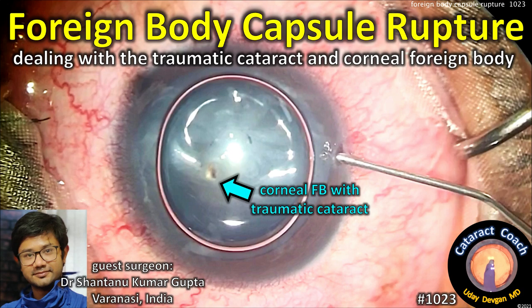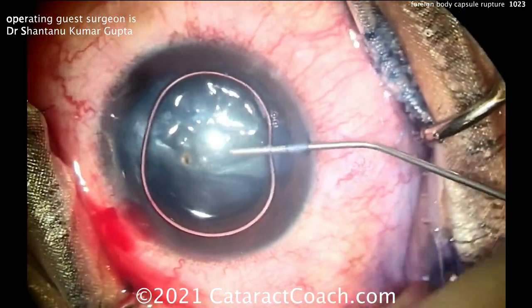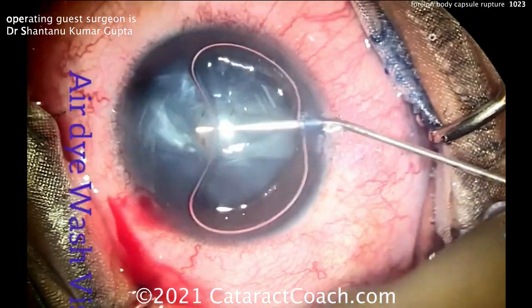Welcome to cataractcoach.com. Today we're dealing with a corneal foreign body and capsule rupture — managing the traumatic cataract and the corneal foreign body. Our guest surgeon is Dr. Shantanu Kumar Gupta from Varanasi, India. This is a relatively young patient.